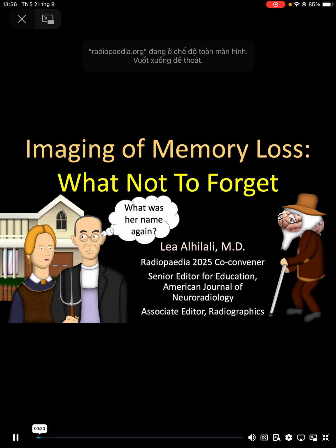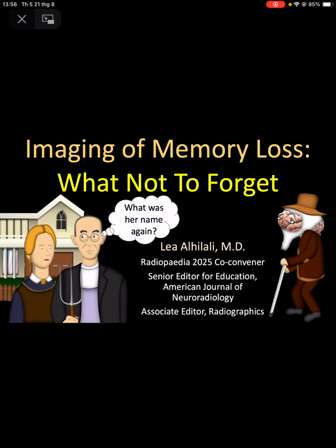So patients with memory loss can get appropriate diagnosis. And no matter where you practice, your population is at risk for dementia, and thus your practice is at risk for a lot of scans for memory loss. But don't fear. I'm going to show you how to look at a scan with memory loss and remember what is important so that you'll never forget it.